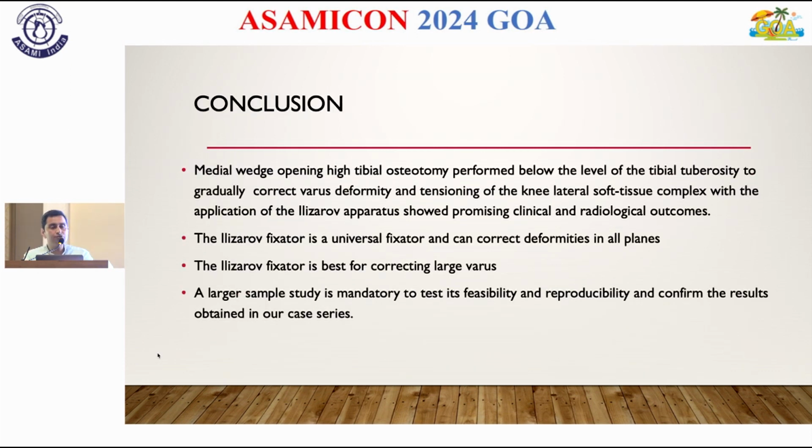So in conclusion, the medial open wedge high tibial osteotomy performed below the level of the tibial tuberosity gradually corrects the varus deformity, and tensioning of the lateral knee complex structures is possible with this frame.